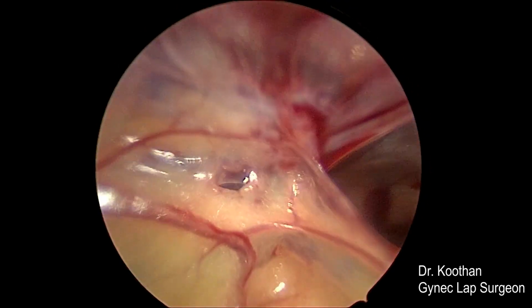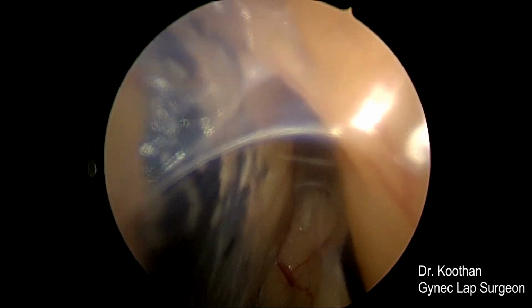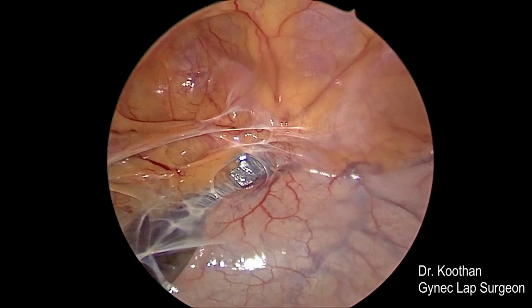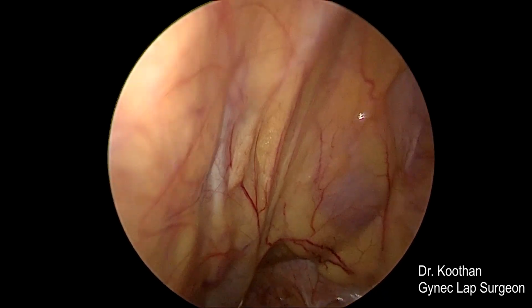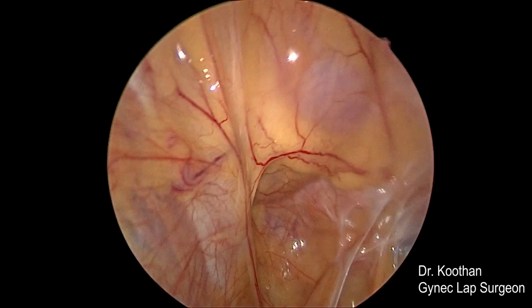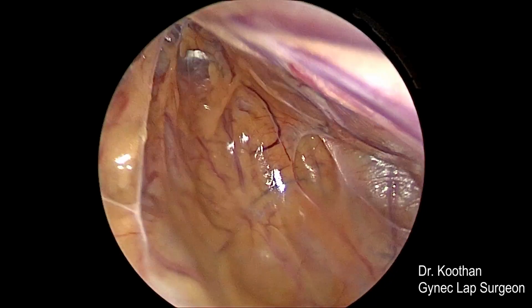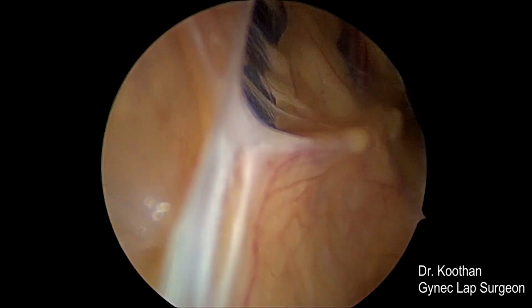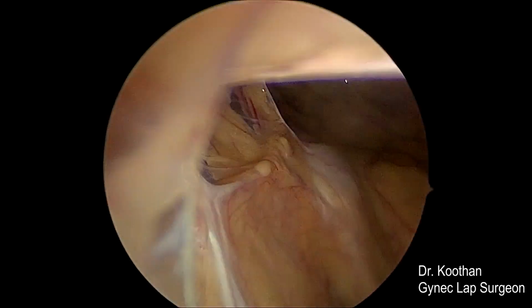After entry, we are seeing only the bowel loops and the stomach completely adherent to each other and also adherent to the anterior abdominal wall. We have entered the cavity with just the 5 scope, and we are inspecting the abdominal cavity. What you are seeing right now is the stomach, which is adherent to the anterior abdominal wall.